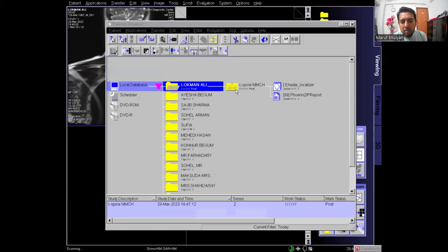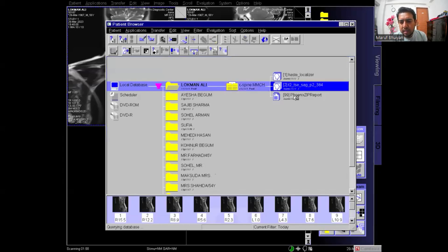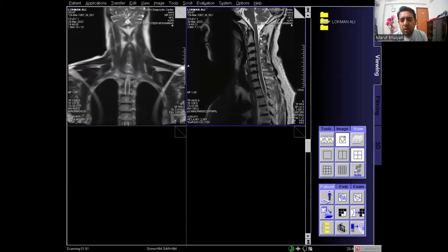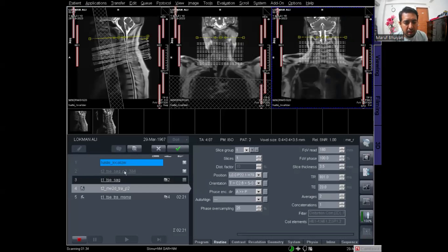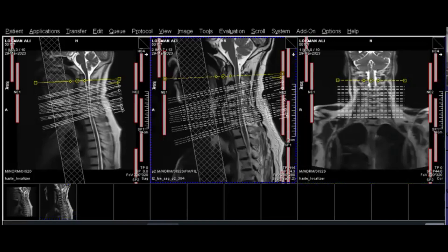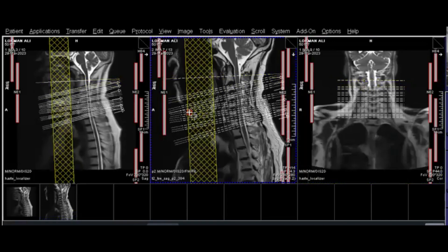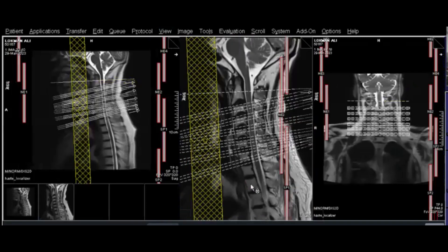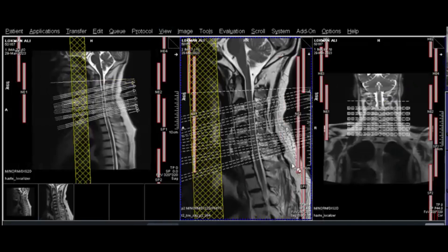From the patient browser I will refresh. When the sagittal scan is complete, it will show in the browser and viewing window. The T2 sagittal image now appears in the viewing window and I am checking the image. Now I have to plan the T2 star axial — I will plan this on the T2 sagittal image. First I have to adjust the saturation band in front of the cervical spine. I am changing the viewing window to spine mode so the segment becomes larger and I can enlarge the image for better planning.